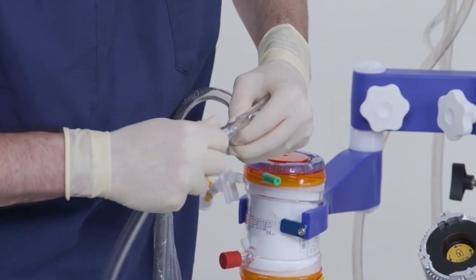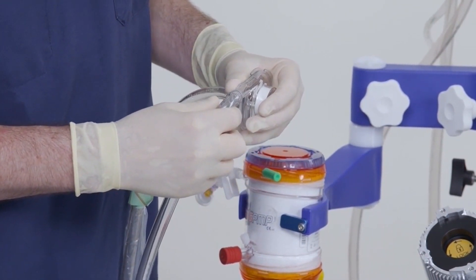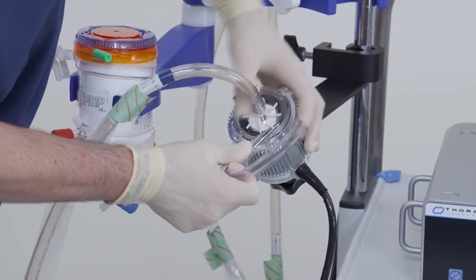Then, connect a 12 to 18 inch tubing to the pump outlet in the same manner. Place the pump in the Centromag motor, securing it with the retaining screw.